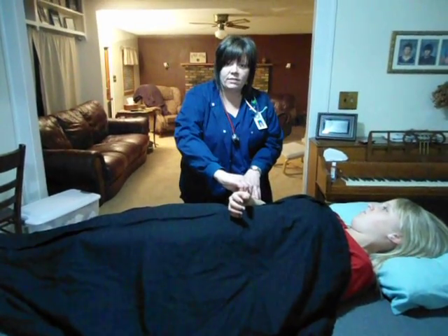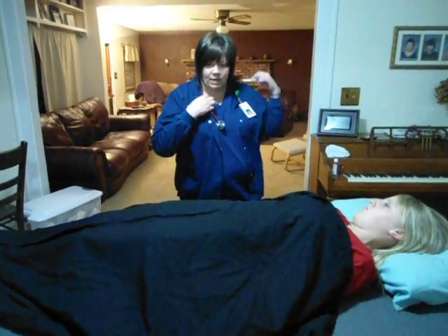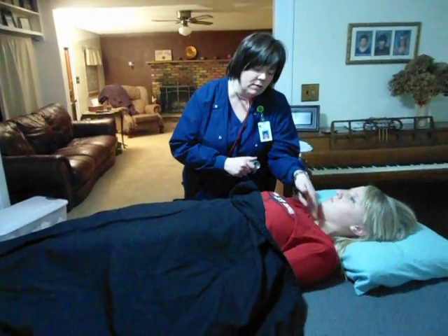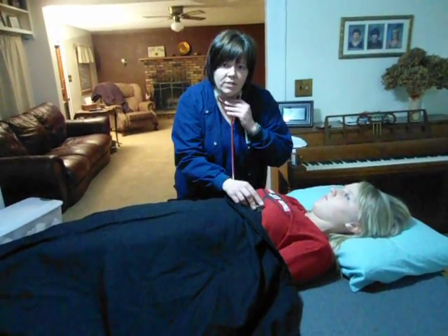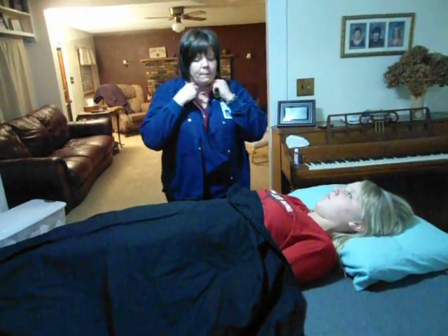If the radial pulse is too fast or abnormal, then I'm going to take my stethoscope and listen for her apical pulse. And that's at the midclavicular line and the 5th intercostal margin. So I'm going to be listening for her apical pulse for a full minute if her radial pulse is abnormal.